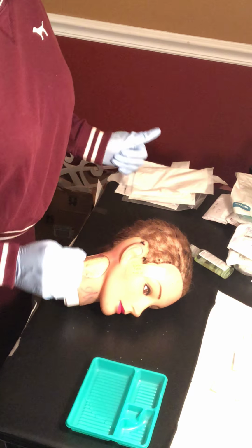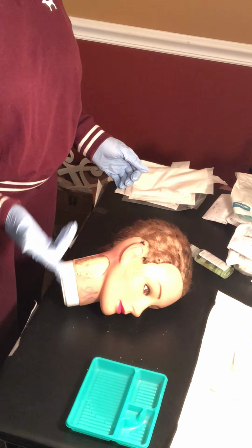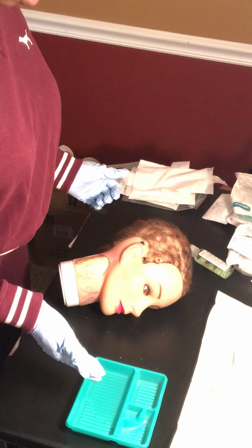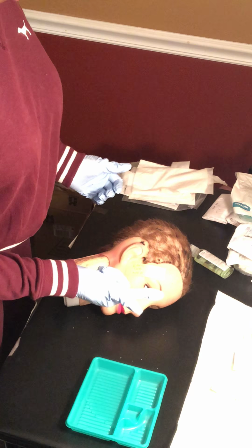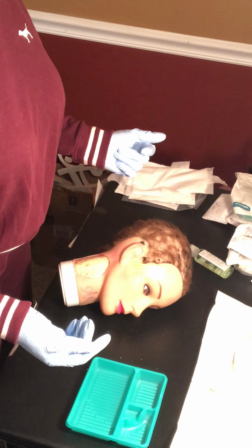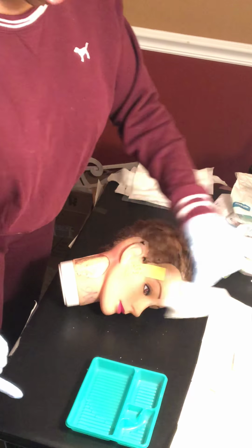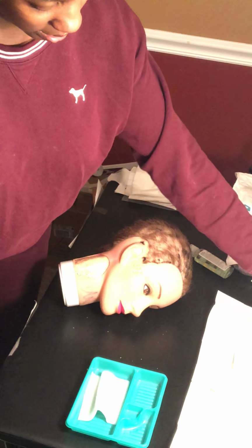So got that done. So I need to clean it. Some people already have gauze in there, but I don't understand how they already have that in there. I don't want to get the gauze from in there because I guess I would contaminate it. But I don't see how I would contaminate it if I got just one thing off the top. Anyway, next time I'll just put them in here.